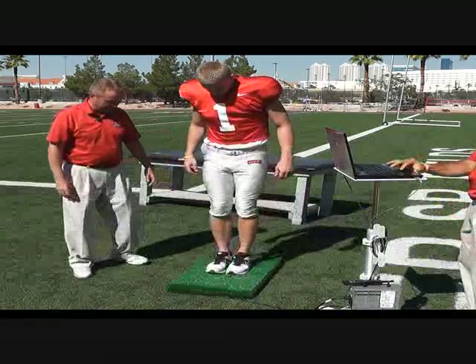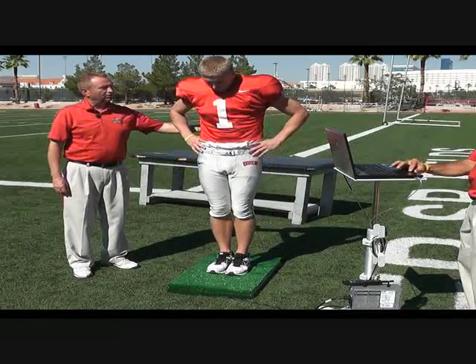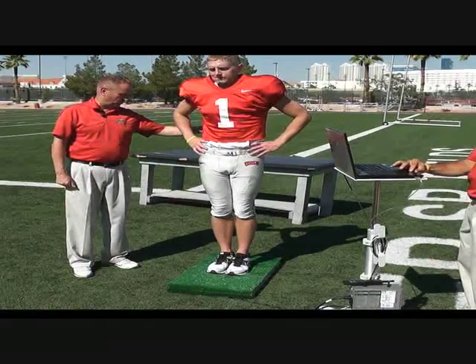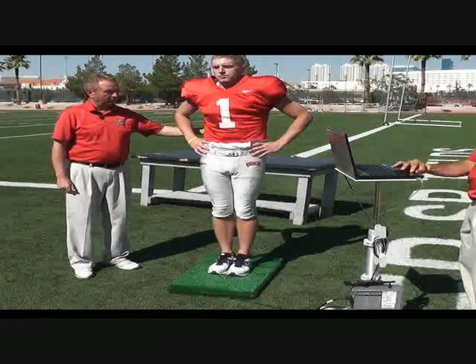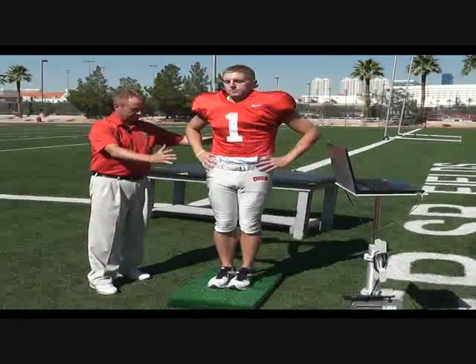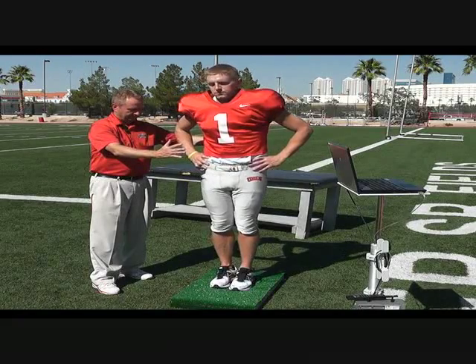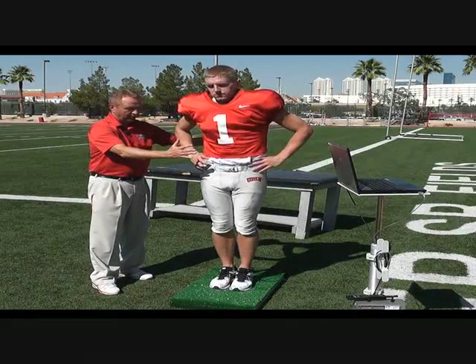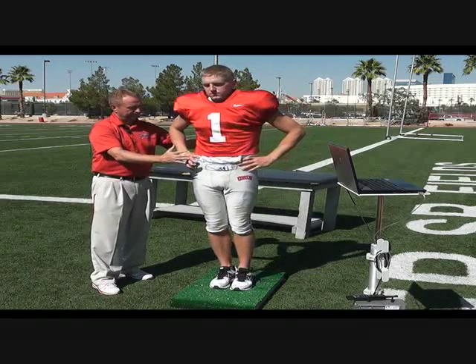I'm going to have you stand feet side by side, centered. Have your hands on your hips. You're going to close your eyes. Now if you feel like you're losing balance, you can open your eyes or step off. But we're going to score you as your eyes are closed here. Ready, begin. And the computer is measuring any sway or movement that you have with your eyes closed. Done.